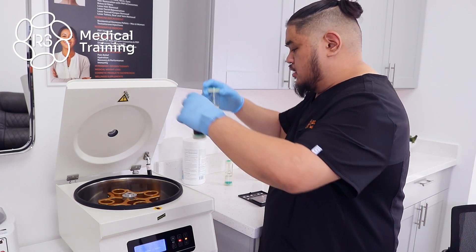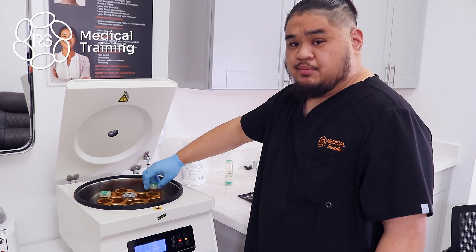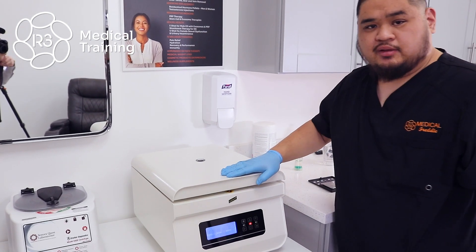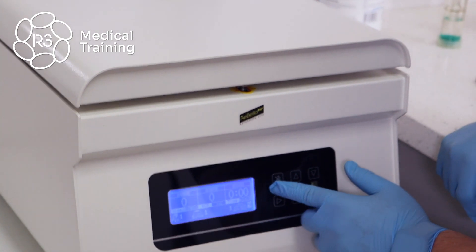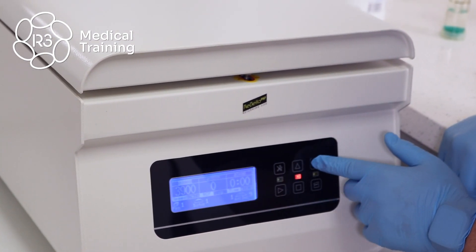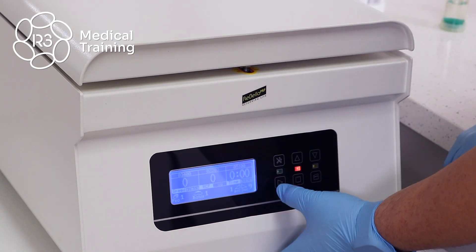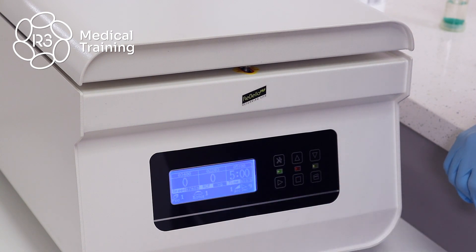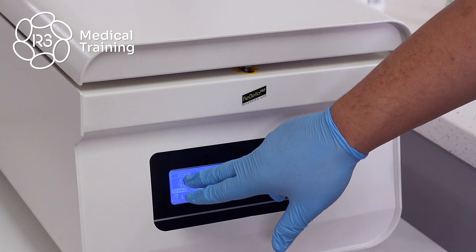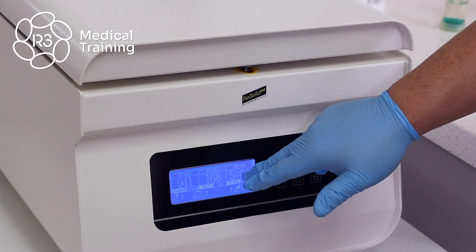To start, you want to place the specimen with blood and the counterbalance in opposite buckets from each other. Securely press down the lid to shut the centrifuge. For our first spin cycle, we like to spin our PRP at 3,400 RPMs for a duration of five minutes. Press the start button twice, and once the centrifuge activates you'll notice the RPM slowly ramp up before the timer of five minutes counts down to zero.